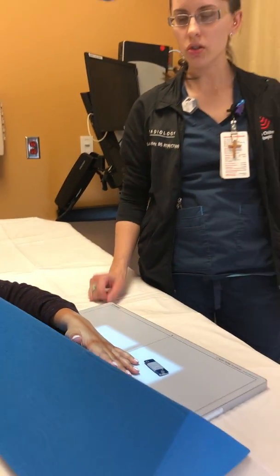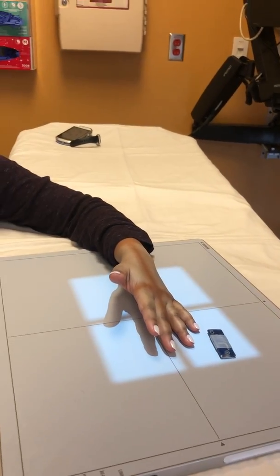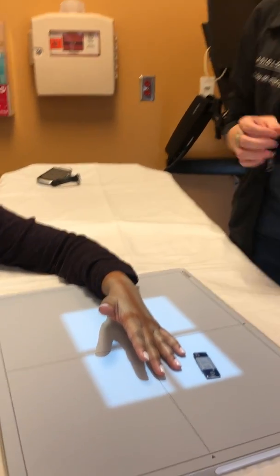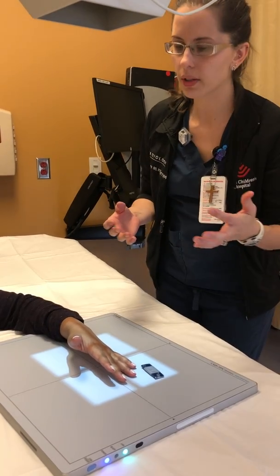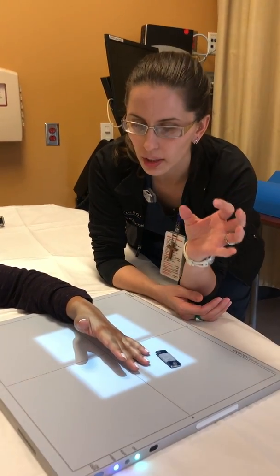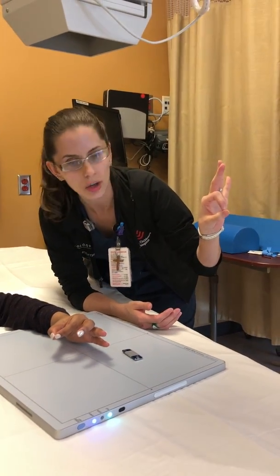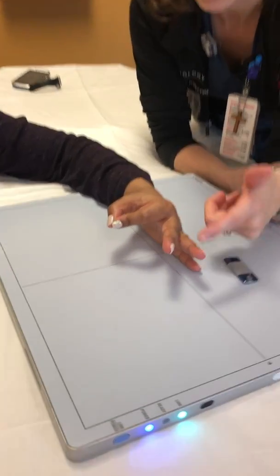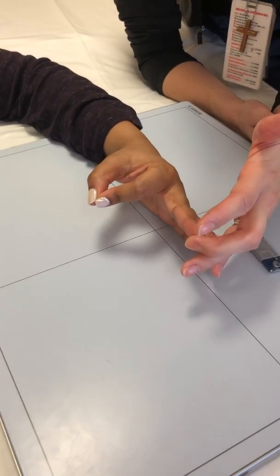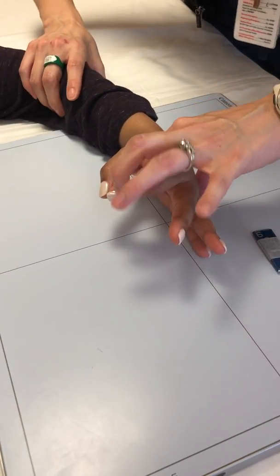All right, so once you've taken this x-ray, now you're going to go to a lateral view, and you do have hand sponges out there which you can absolutely use, but I'm going to show you the free-form way of doing a hand x-ray for lateral position. I always tell my patients, give me an okay sign, start with that. As you notice, the fingers are sort of splayed apart. Sometimes people will line them up a little bit, and that's okay, you can address that in a minute. So we're going to reorient this a little bit.